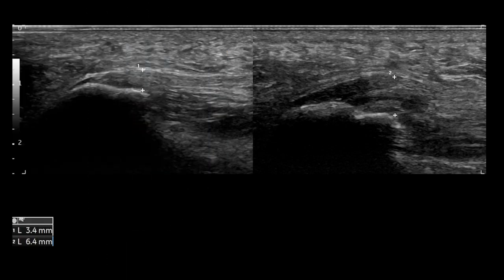This is an example of pathology. On the left-hand image we can see a normal plantar fascia measuring less than four millimeters in thickness, and on the right a markedly thickened plantar fascia at 6.4 millimeters. This is what we're looking for — gross, significant changes in thickness that are easy to identify — and it's always useful to compare to the contralateral limb.